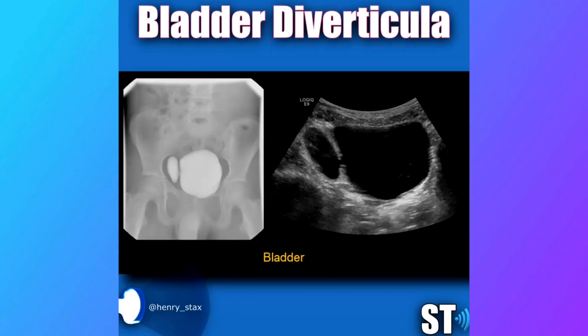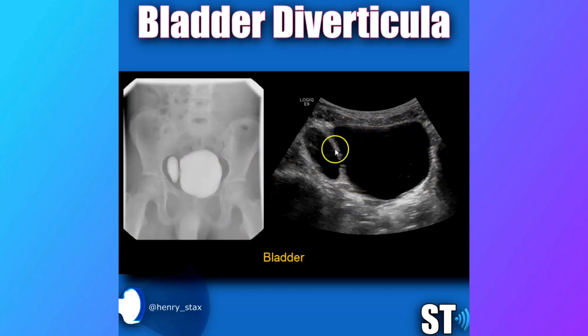Today we're going to go over bladder diverticulum. A bladder diverticulum is an outpouching of the urinary bladder. Here we have two images of the urinary bladder — a transverse ultrasound where you can see a normal bladder, an oval-shaped structure with a channel, and this is a diverticulum. And this is a radiograph with contrast.